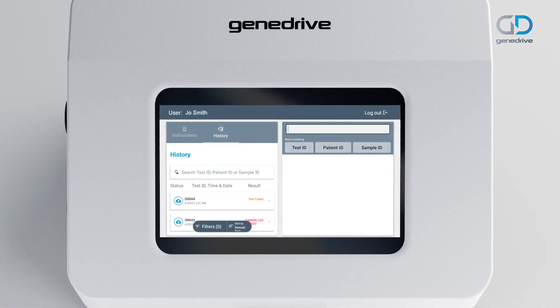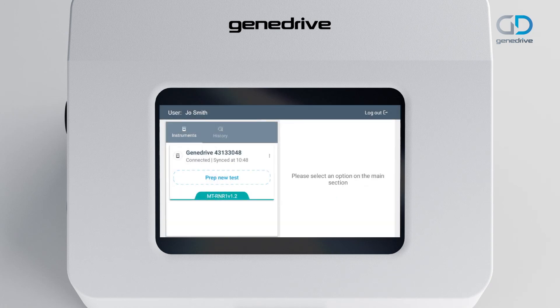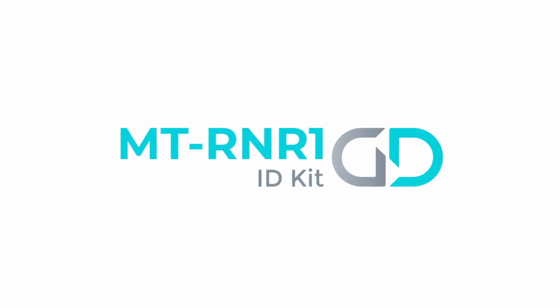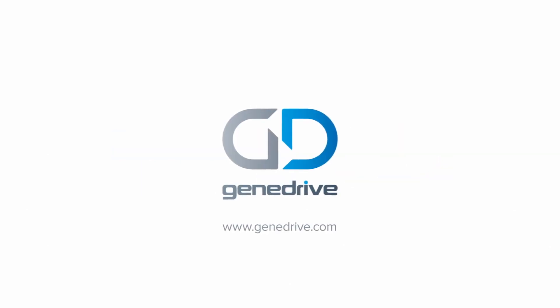A log of previous tests can be searched under the History tab by Test ID, Patient ID, or Sample ID for up to 999 results. Tests can be exported via a number of options, including to a secure server via email, Bluetooth, or saved locally. To log out of your user account, press the grey button on the top right-hand corner of the screen. To find out more about the GeneDrive system and the MT-RNR1 test, visit the website at www.genedrive.com.